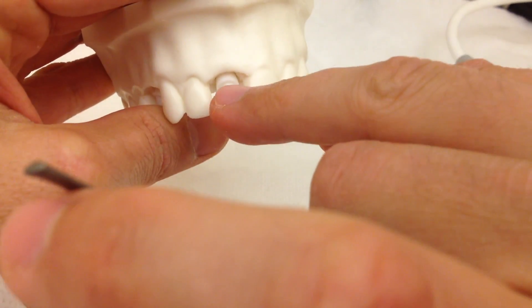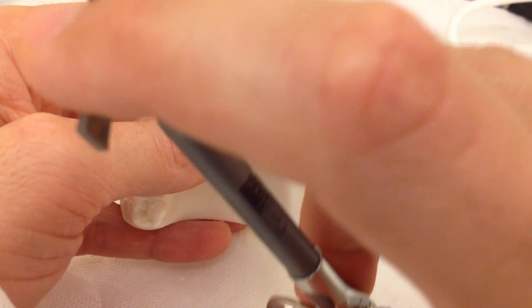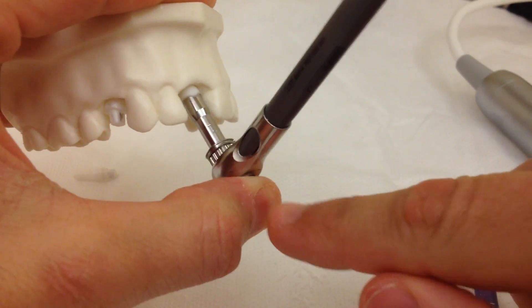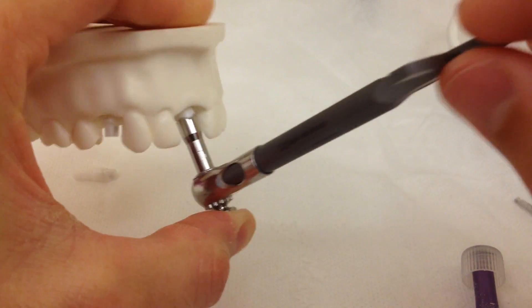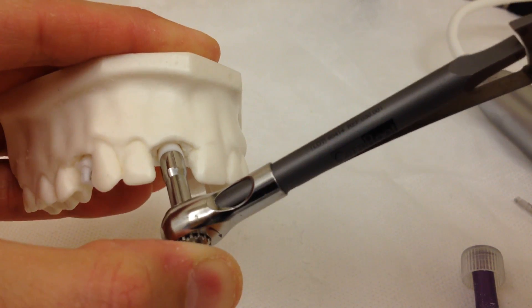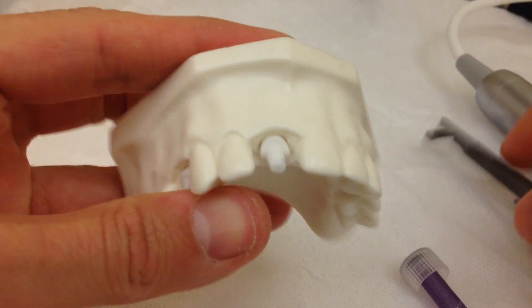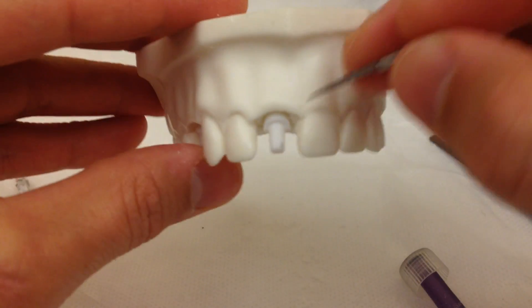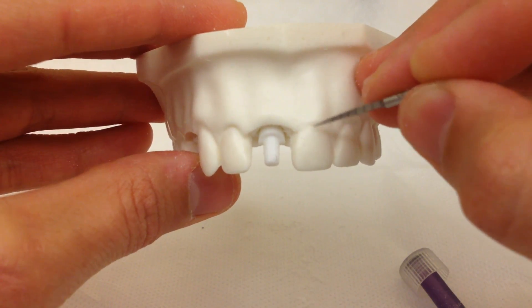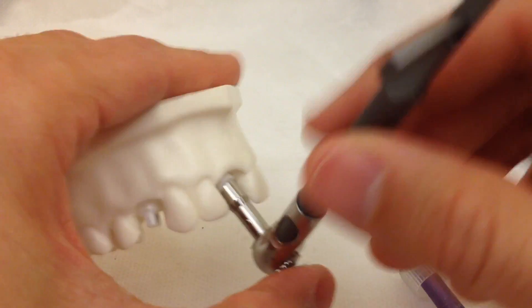We can still go deeper — this is the shoulder of the implant. The goal is to place the shoulder of the implant more or less at the same level as the CEJ of the other central incisor. We're going to keep screwing, pressing down so the implant does not spin in place. We still have about 20 Newtons of torque. Right now the vertical line is perfectly on the buccal, so when we remove the driver we can check the situation. The shoulder of the implant is slightly more supragingival than the CEJ of the other central, so there is still room to go deeper. We're going to do 180 degrees more.